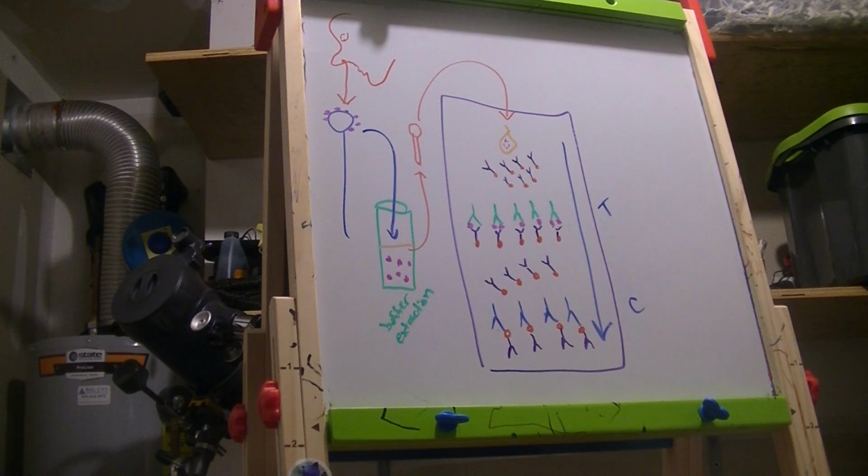This is the exact same principle that we use for the HCG test. The only difference is that the antibodies in an HCG test will bind to HCG antigen in the patient's sample. In this example, those antibodies are binding to antigen on the flu virus.